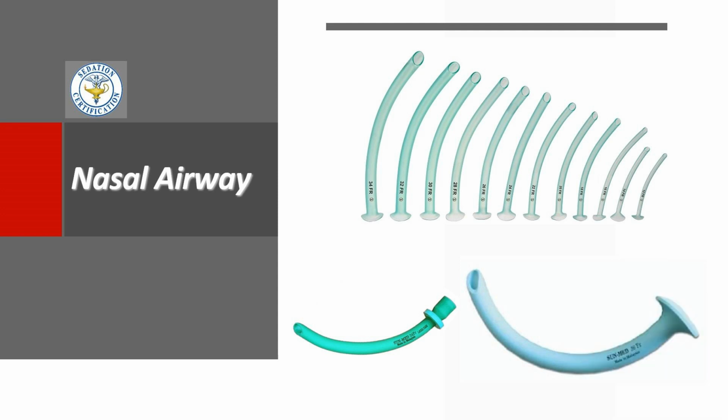So the point is, if the right one's clear, you don't need to worry about the left one. But if the right one doesn't blow, now you've got to find out, what about the left one? Which means you may have to look at a smaller airway instead of a larger, the size you might want to use. So it's just that simple little technique.